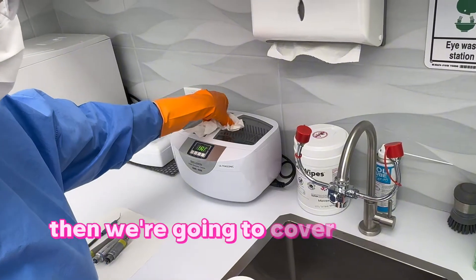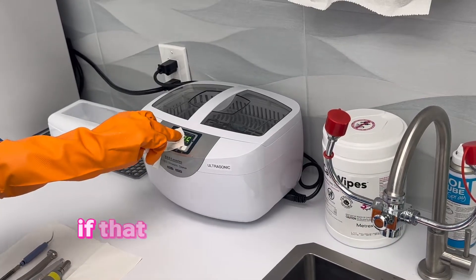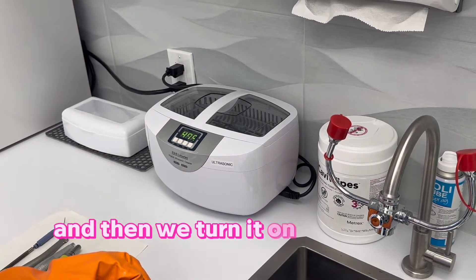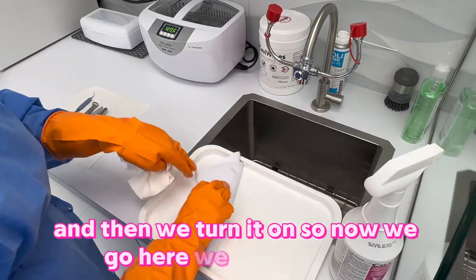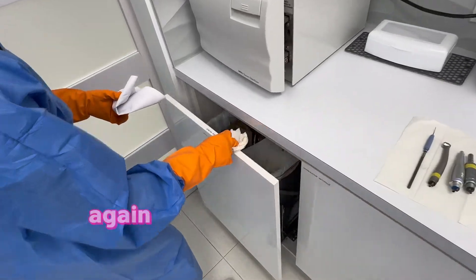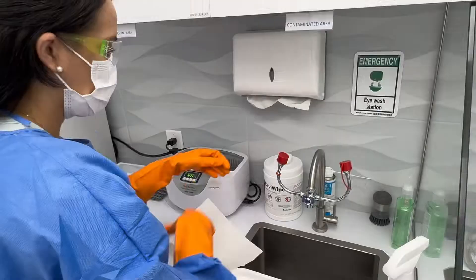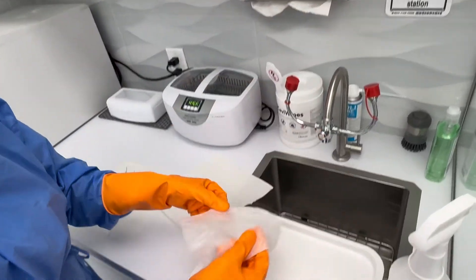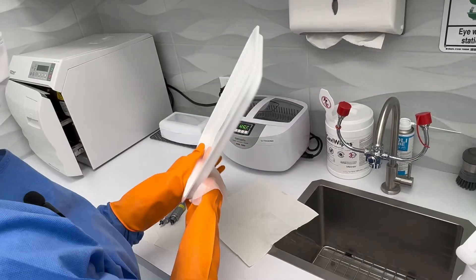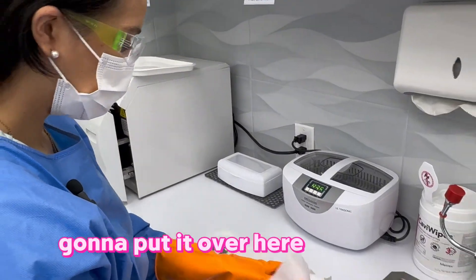We're going to cover the ultrasonic and turn it on. If the timer is not set, we can set it up and then turn it on. Once it's done we take the tray out, and avoiding cross contamination, we're going to throw out any disposable items.